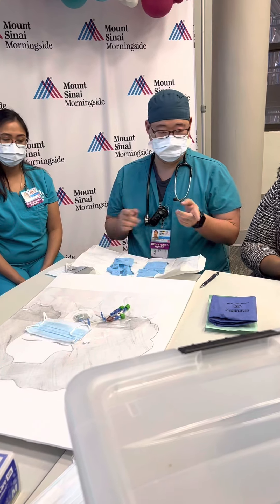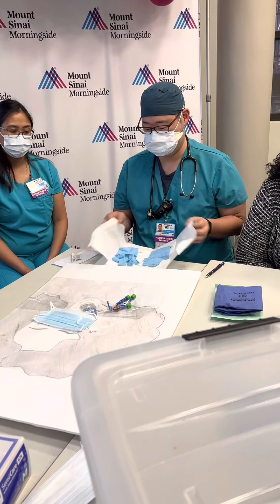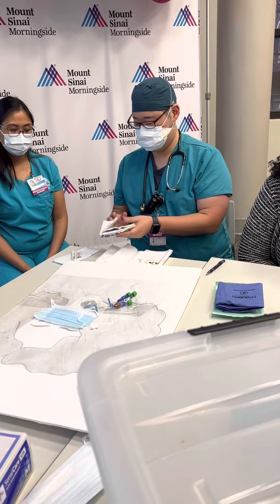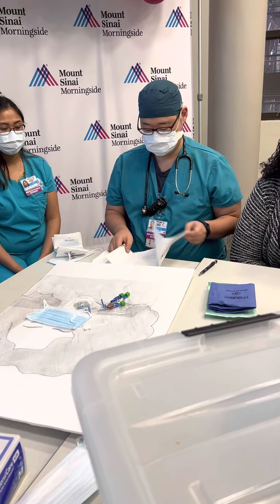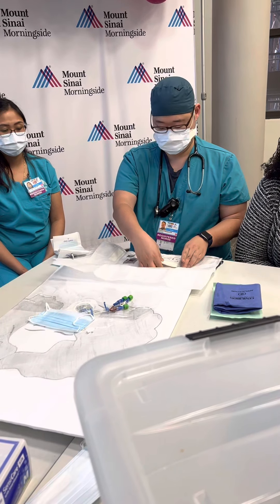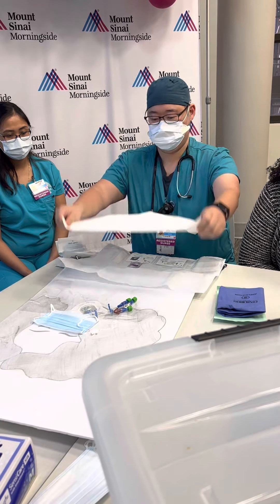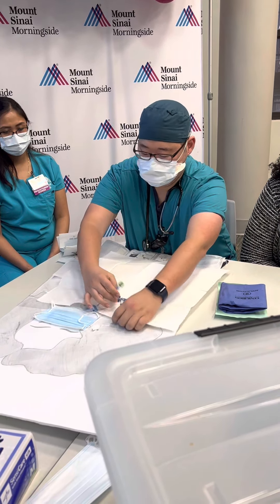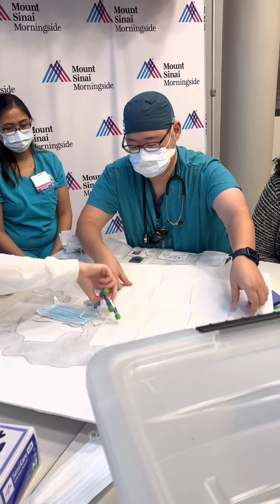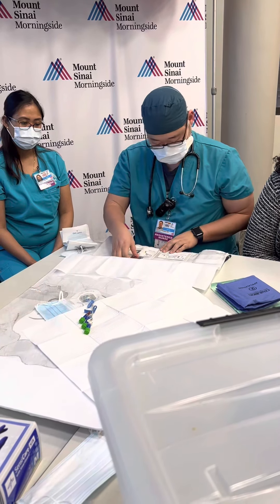So where does this drape go? It goes underneath. Yes, very good. You're covering up your line here, so angle it so you're not covering up the insertion side — like this. Great.